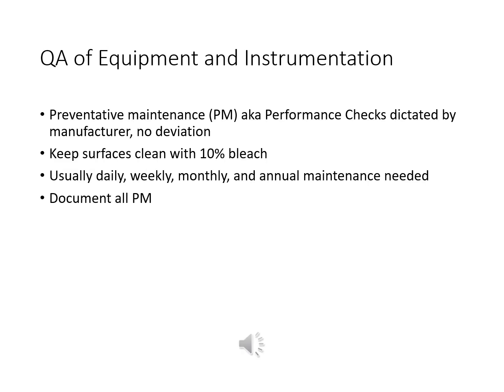Quality assurance of equipment and instrumentation. You will also run maintenance and preventative maintenance checks on your equipment. So the frequency of what those are is going to be dictated by your manufacturer, and there's really no room for deviation. If they tell you it has to be daily, make sure you're doing it. Keep surfaces clean, generally with 10% bleach.